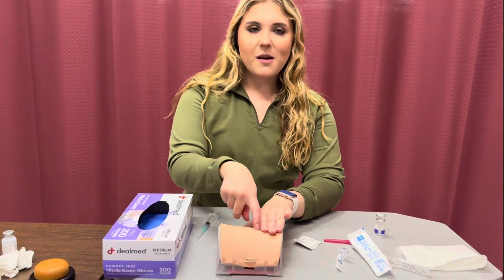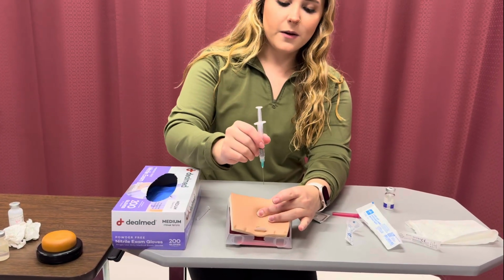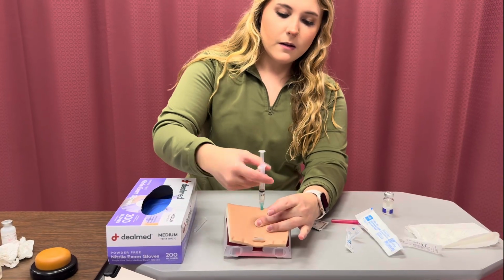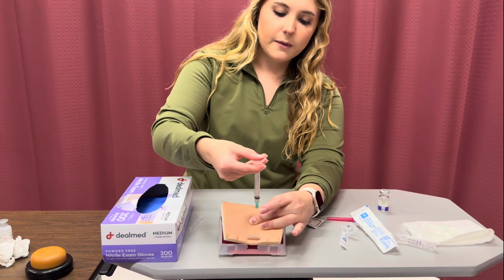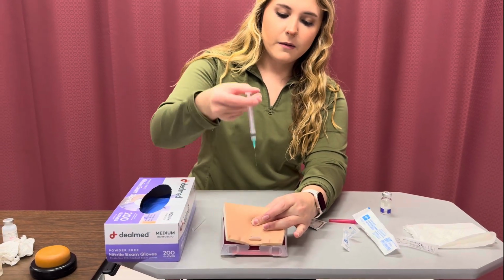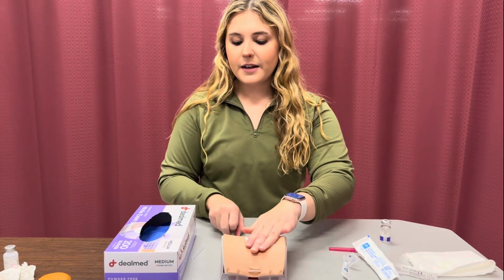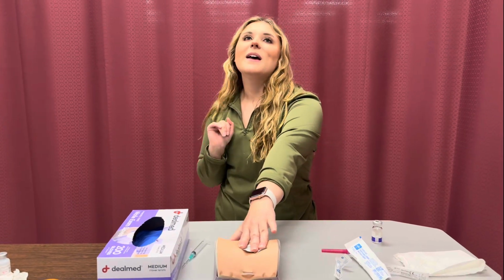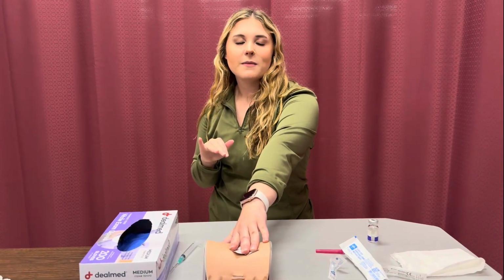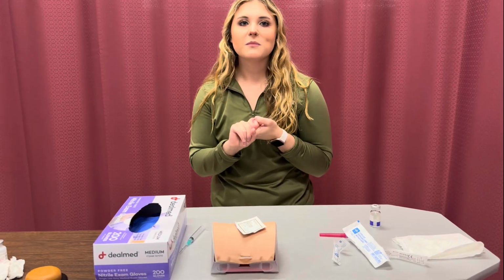3 fingers right there, squeeze, remove the cap, go at a 90-degree angle, and then push it in. There we go. Hold it in for a couple of seconds. It'll come out. There we go. And I would get my little swab in case they're bleeding, cover it, and dispose of everything in the sharps container. Before leaving the room, I would make sure all my safety checks: bed alarms, bed in lowest position, rails up times 4, brake set, and call light within reach.